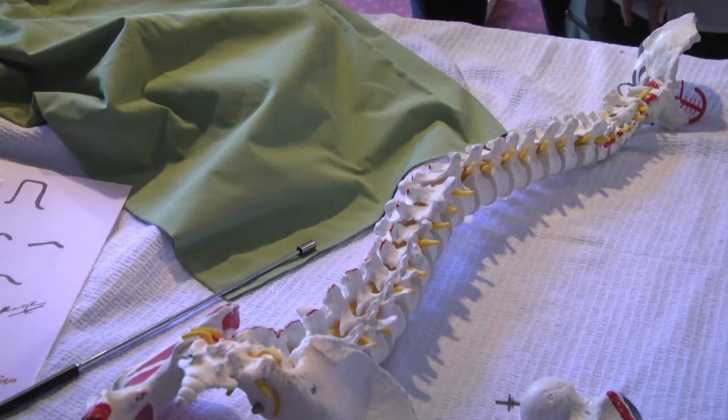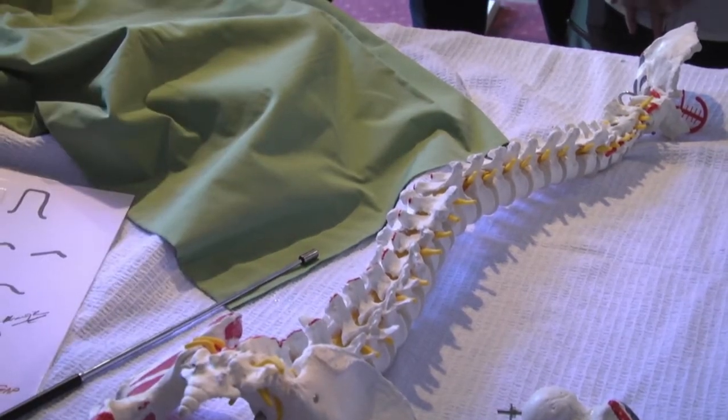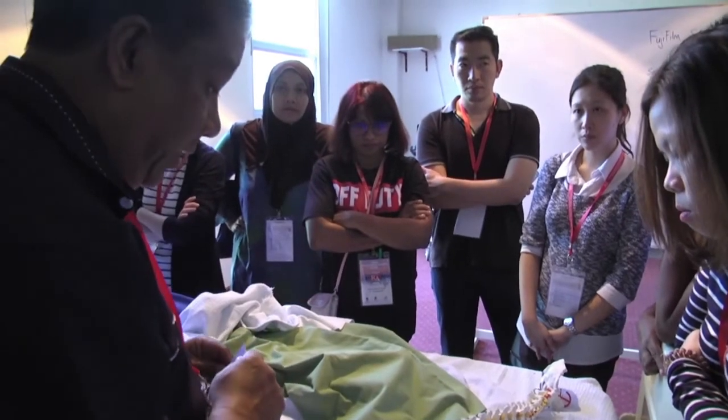This is one of the errors that the practitioner yesterday was having. He was looking at the articular process, trying to put the needle into the spinal canal. That's why they were hitting the bone all the time. But anyway, it's something you will learn by practice.